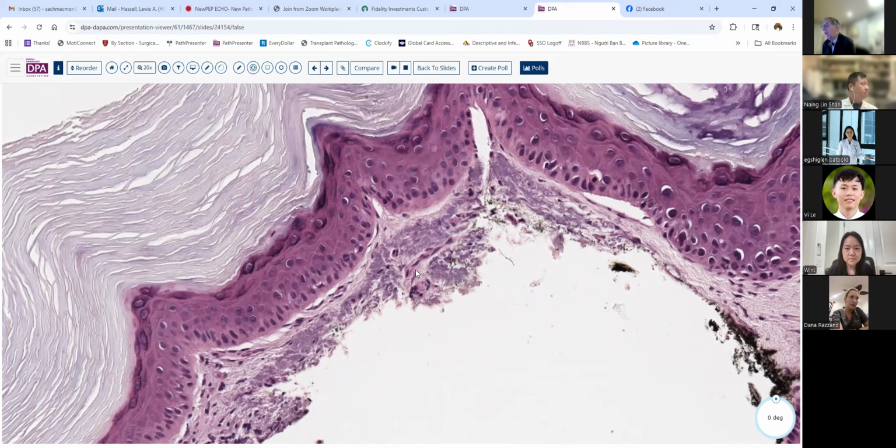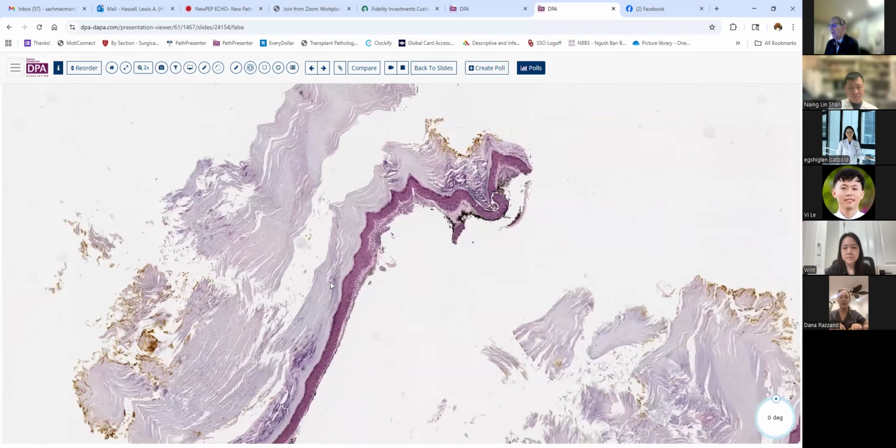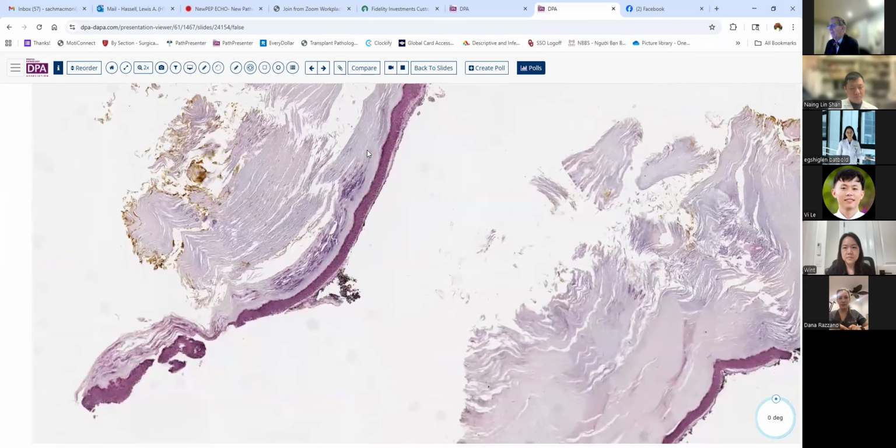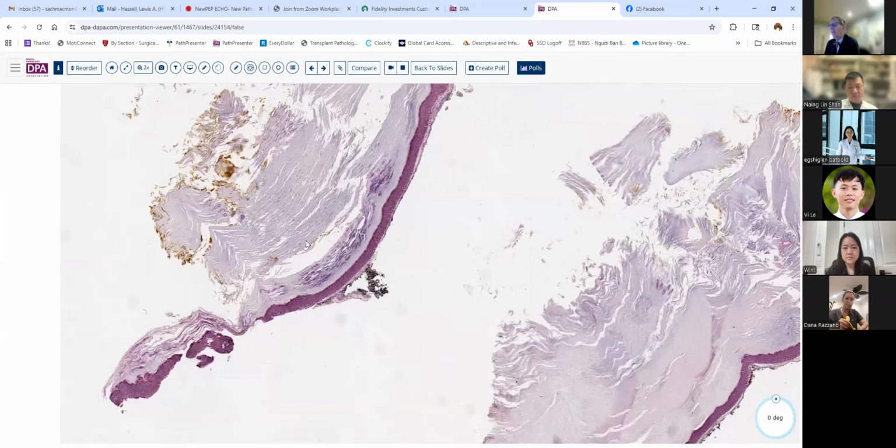that are related to that solar damage. And that highlights the fact that staining differences can vary quite significantly between laboratories. So in this laboratory, their hematoxylin was sufficiently intense that it was picking up the elastosis with a fairly nice bluish purple color, whereas in the previous one, it was just a very, very slight pale blue. So the recipe for staining can be variable. Pathologists' eyes are good at making that adjustment, and so forth.